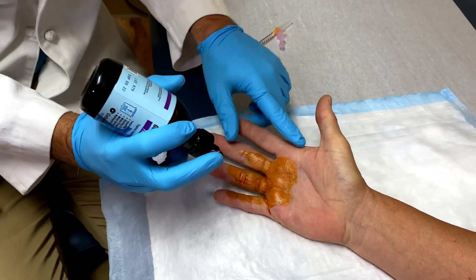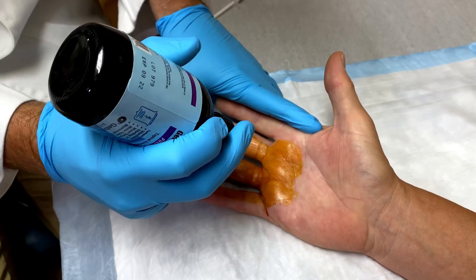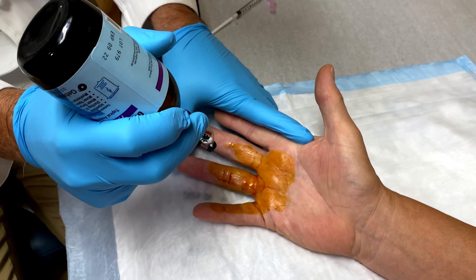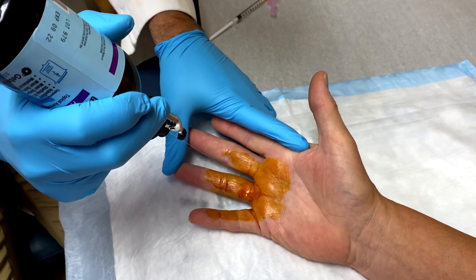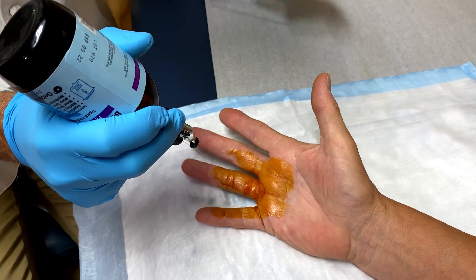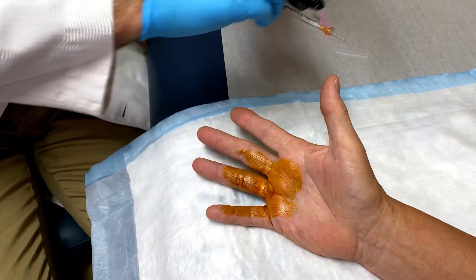We're going in right at the flexor crease there, or a little bit this side of it. It's cold — almost at the point of hurting. It feels better than the shot. So while I'm doing that, I will get the needle free over here. There, you can see that.